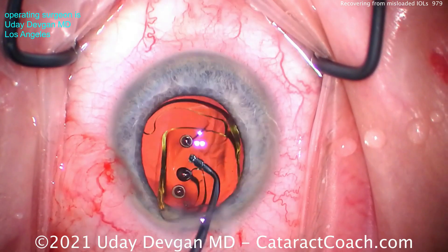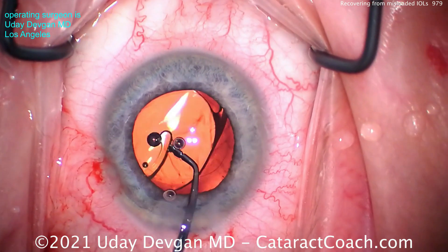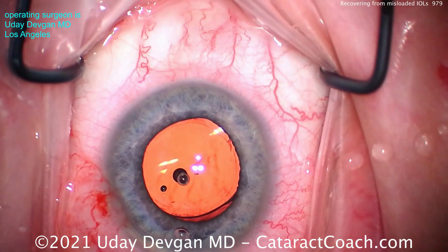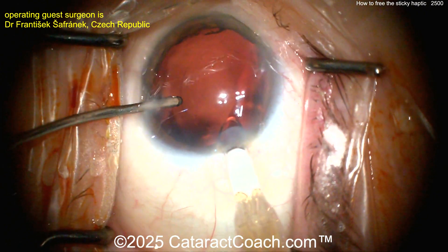I know other people have advocated to just throw the whole lens away and abort the insertion — you don't have to do that. You can remove this sticky haptic from the optic, and beautiful — now it's in perfect position. Now a reader submitted this video — watch this: a special lens with four haptics going inside the eye.